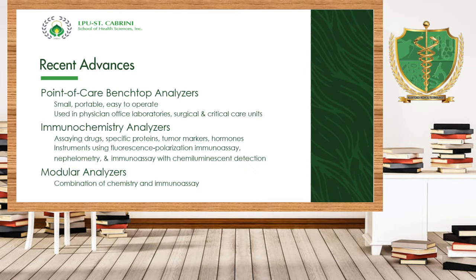No, and another problem with that is the example that you had, the glucometer, uses what? It uses a battery. It's battery operated. So meaning to say, if the battery has low energy na or mababa na yung supply niya ng energy, it is prone to error.